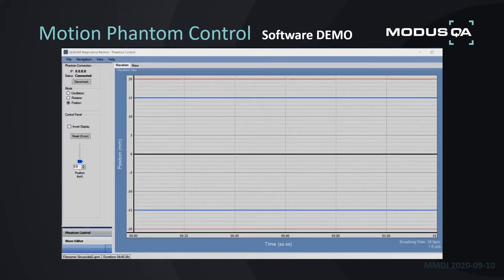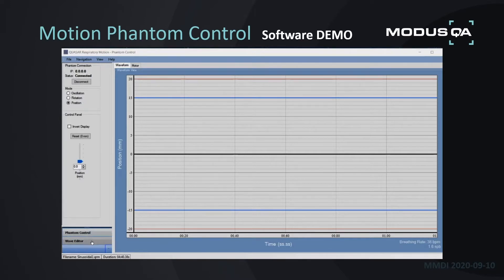I will now provide an overview of our Motion software, which is a simple application to use. On the screen, in the bottom left, there are two main windows. The first is Phantom Control, where you'll operate your Motion Phantom, and the second is the Wave Editor, where you can make adjustments to any captured or imported waveforms.